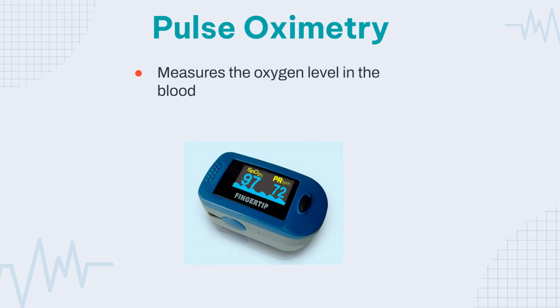This is pulse oximetry, and it measures the oxygen level in the blood. On the left side of the picture, it says SpO2 and 97. That is the oxygen. Normal is 92 to 100. On the right, it says PR, BPM, and that's the pulse rate. So that person's pulse is 72.